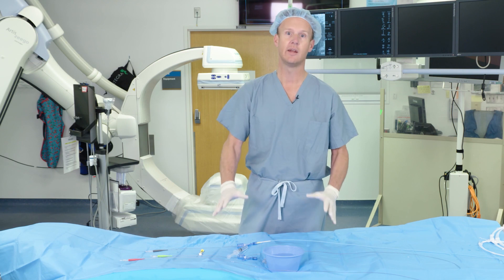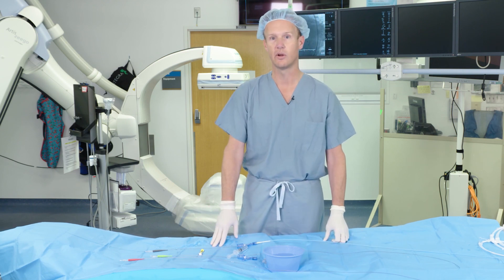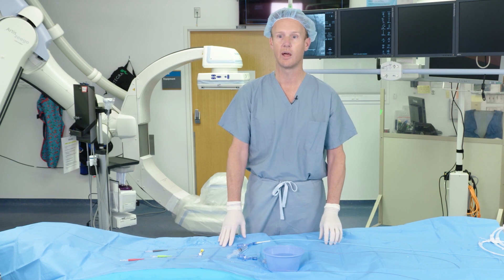In terms of the actual day-to-day use of this catheter, we're going to go through an example of how it's used. There are basically two techniques I use in terms of torquing this catheter and moving it forward.